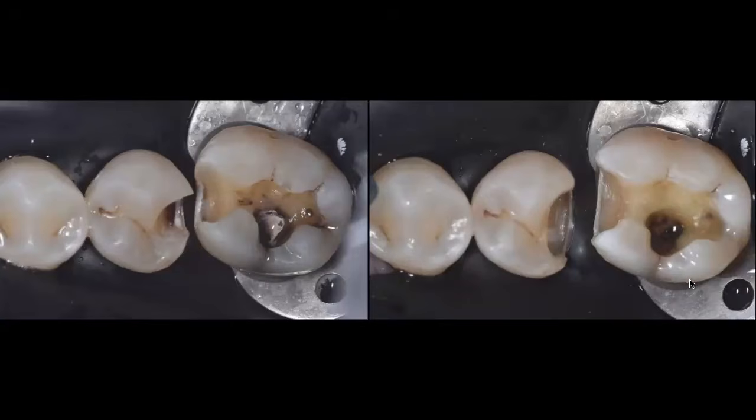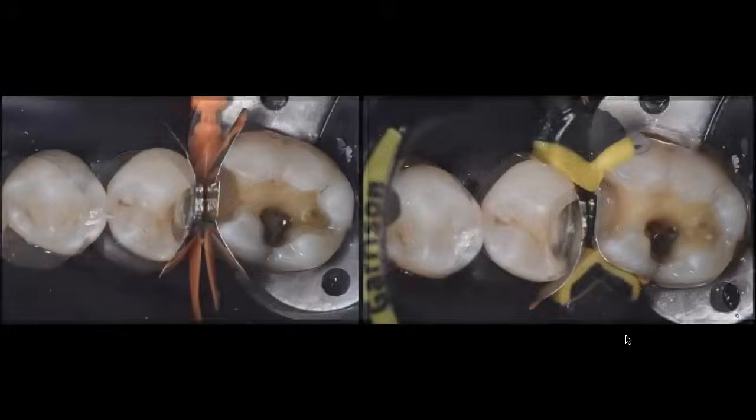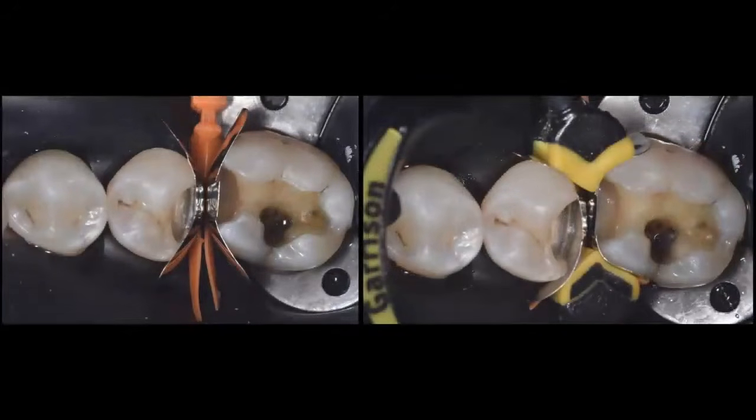Now, why bevel enamel? Because we all know that in the beveled enamel, you have now sectioned the heads of the enamel prisms, and you're going to get a better bond strength in those areas. So there are a lot of things playing an important role in these bevels that you see that I've created in those two proximal boxes. Now, once I've created the bevels, I place these Garrison bands.